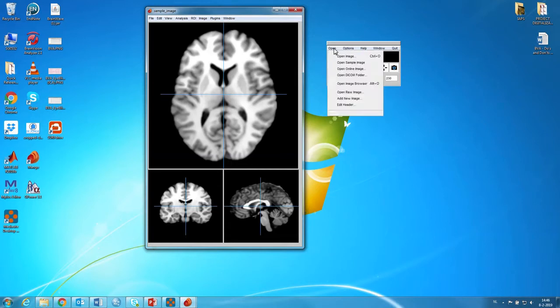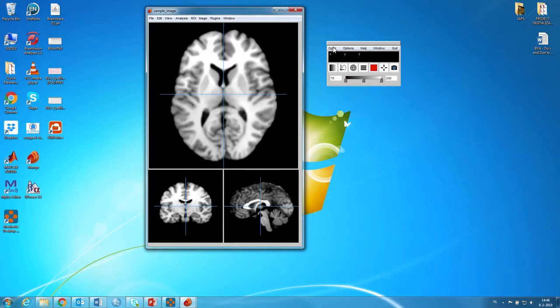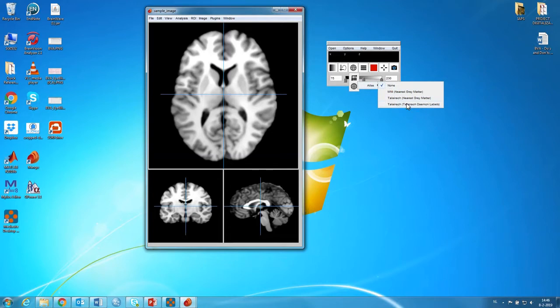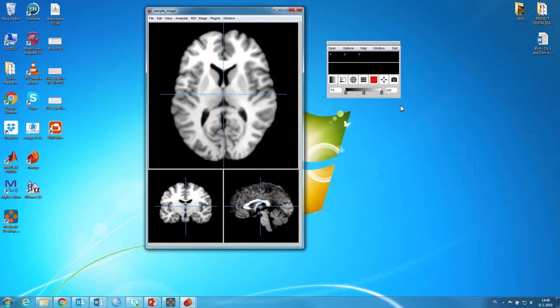Then another thing I'd like to show you is that you can actually... what you can do is select a specific atlas. And the best one to select now is the... I always have trouble with the name. Talairach. Talairach. Yeah. Atlas. You can just select it.